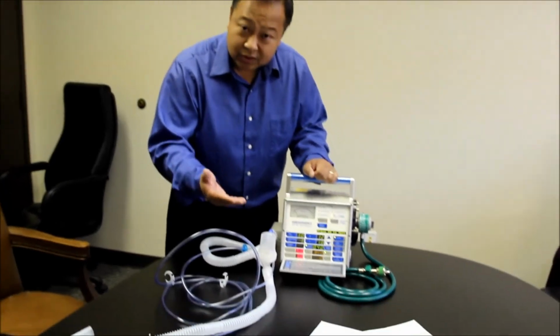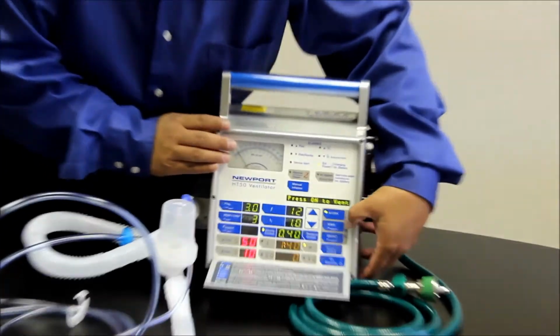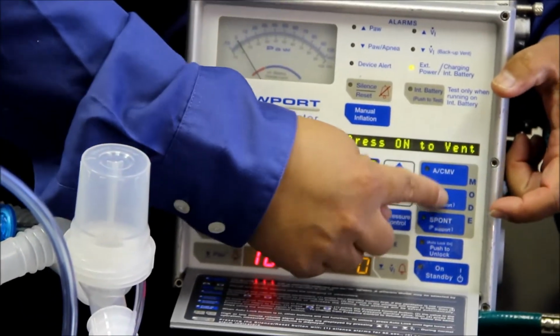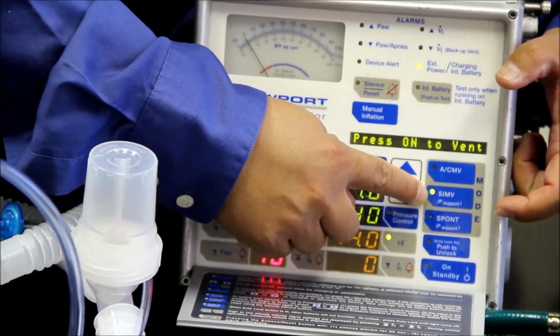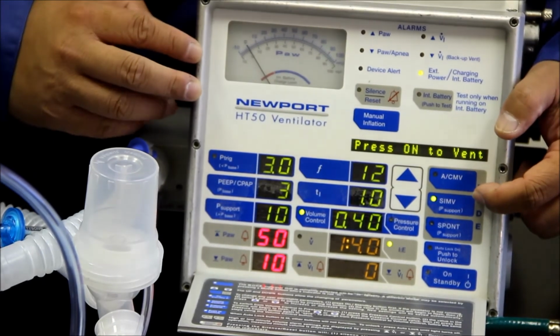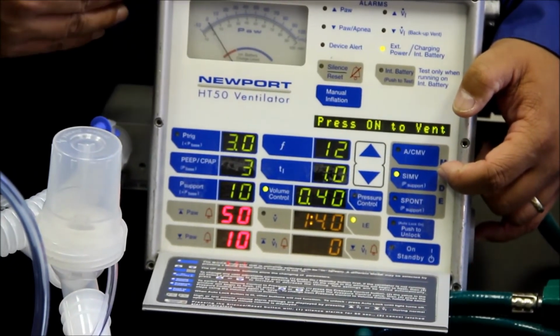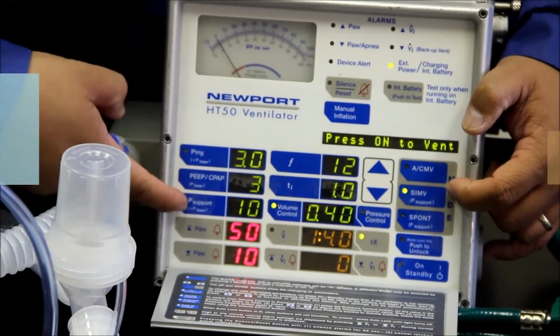To do that, we just go ahead and change the mode. So we'll just hit SIMV, it'll start blinking, and so now when it's lit up green, we have the patient on SIMV mode. The only different thing about SIMV mode that the AC mode didn't have is a function called pressure support.